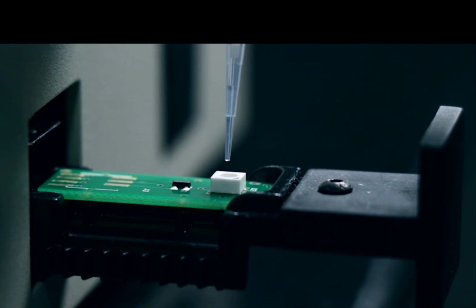Please don't touch any portion of the chip. You should not even touch the white sample well also. Just stay above it and form a drop. Once you press it fully, one drop will be formed. Once the drop is formed, just touch with the drop. Don't touch with the pipette tip, touch with the drop.